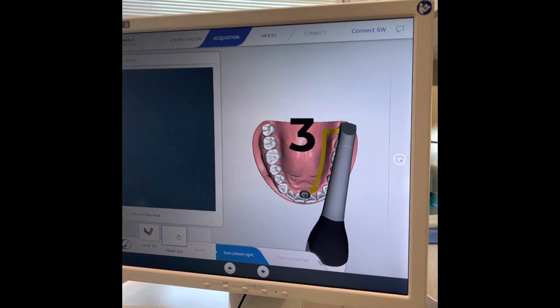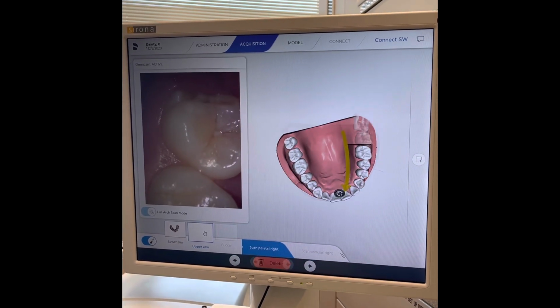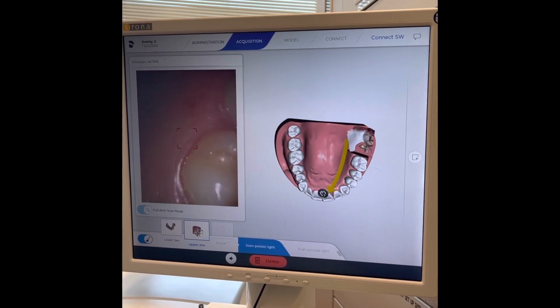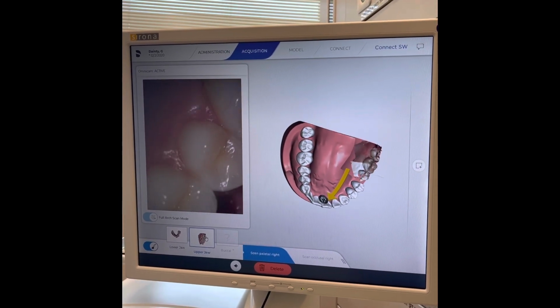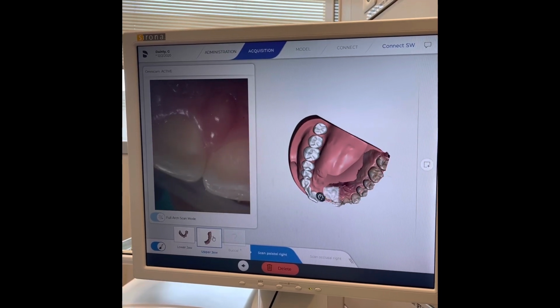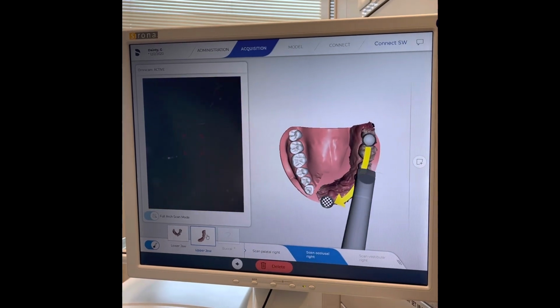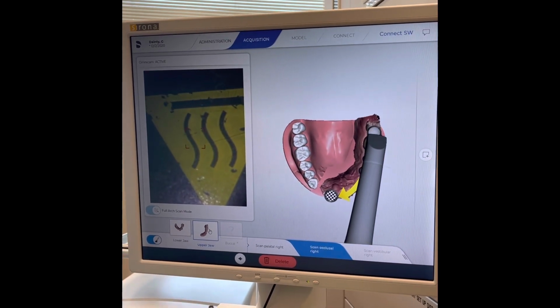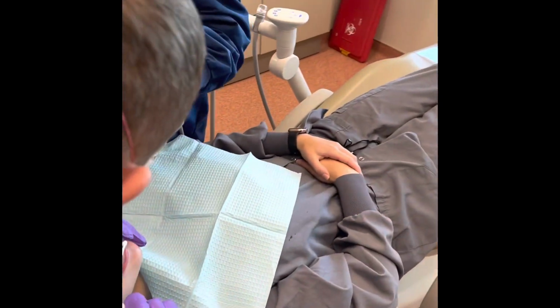Okay, so the upper jaw, a little bit of airfoil, Miss Flores. Perfect. Okay. Now, if you want to start from scratch and use the powder for your entire scan, you can if you have good isolation. So I'll show you how much quicker the rest of our scan is going to go. So hold that low back section in for me really quick. We're just going to degloss all of Dr. Dainty's teeth.